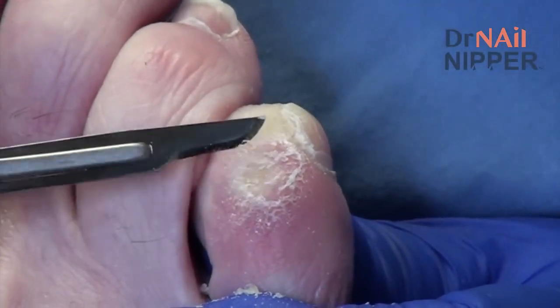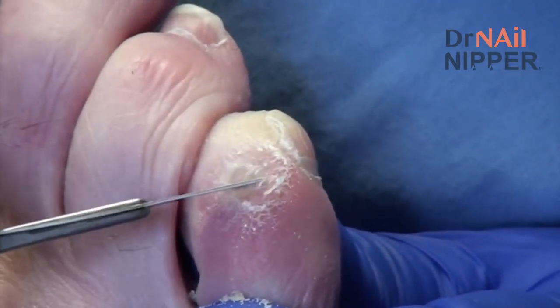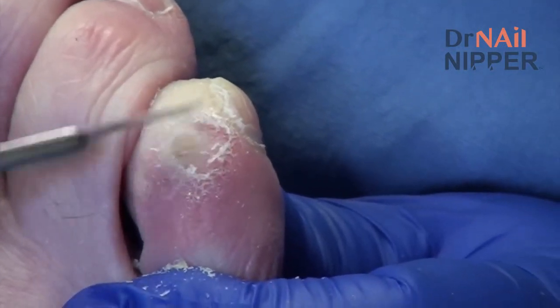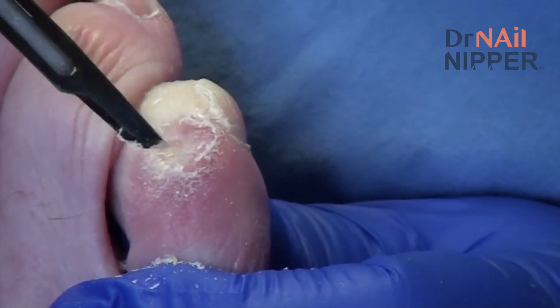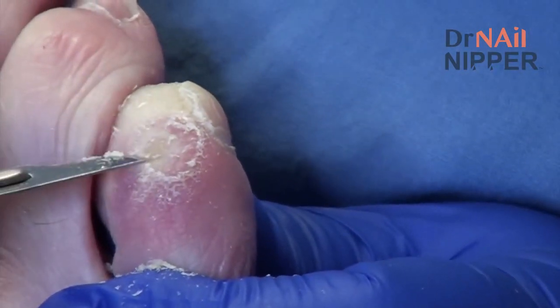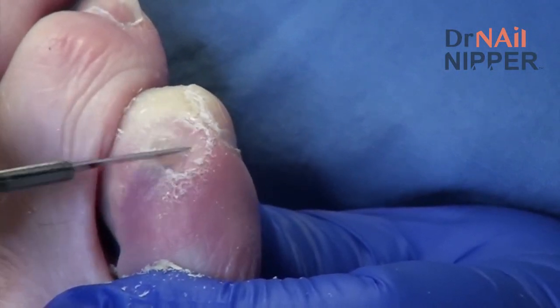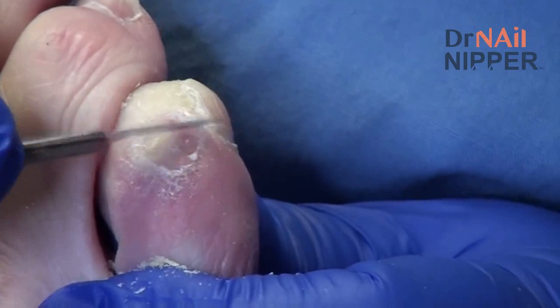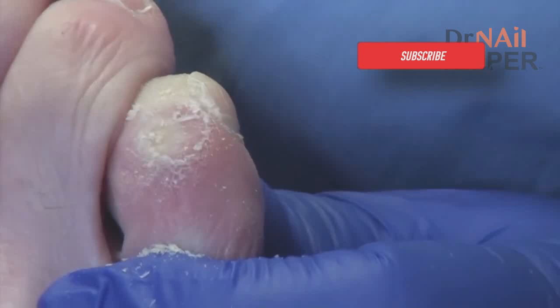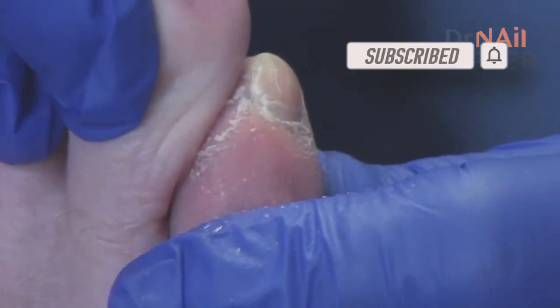Okay, so I'm not seeing an open sore underneath this, which is good. Sometimes when the little corn here gets too thick it can be super painful. Wait a second, maybe I spoke too soon. So all the skin there is intact. Now what we need to figure out is how are we going to protect that little spot from hitting up against the other bone.